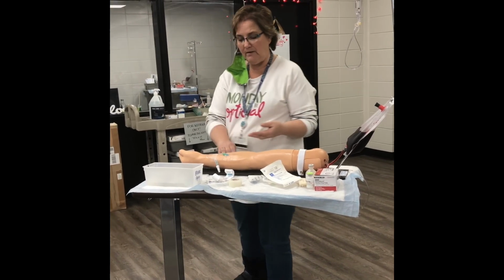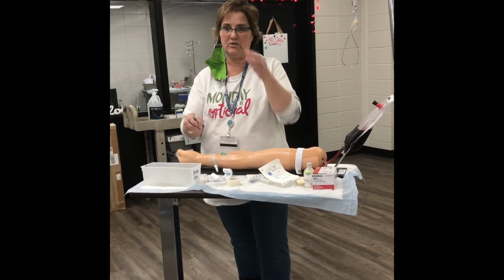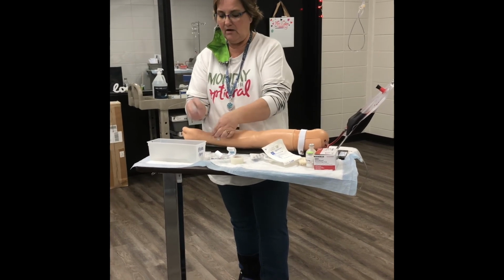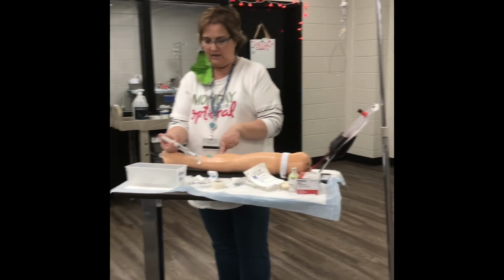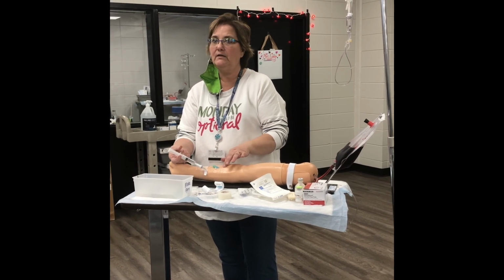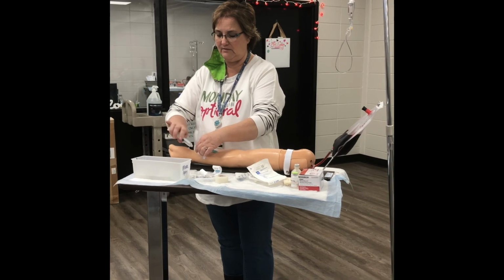This site looks good, but I'm still gonna go ahead and flush it, even though I had fluid going, just to make sure. What if she just knocked it loose? So you're gonna clean that with alcohol. I'm gonna make sure you have the air out. You're gonna hook this up without contaminating it, and you're gonna flush it just like you did when you put it in. 1 to 2 milliliters, looking for swelling, or complaints of pretty significant pain. I don't have any, so this is good.